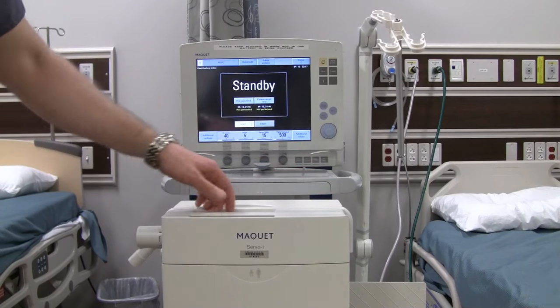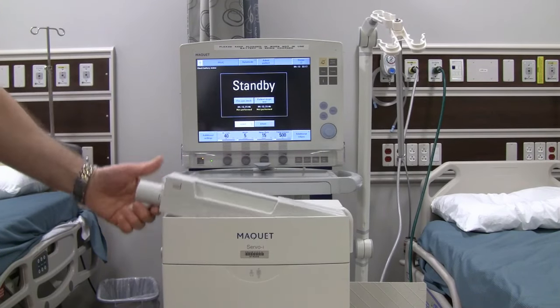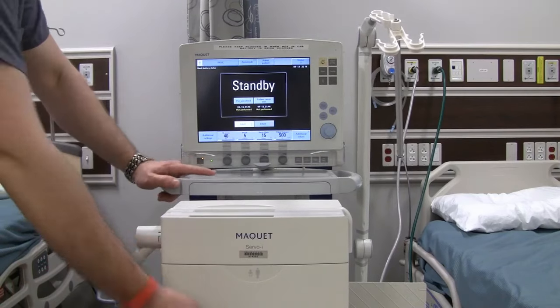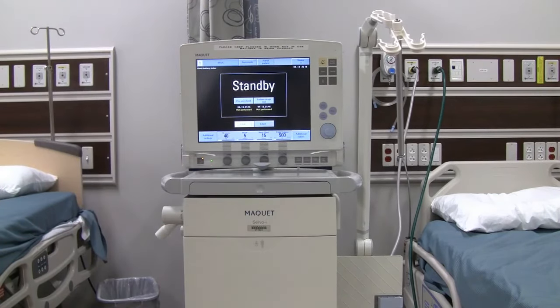We have our expiratory filter right here on the front at the top, so we can go ahead and pop that out. This can be replaced after it needs to be switched out. After that is done, pull up on your handle — it slides back into position and locks in place.